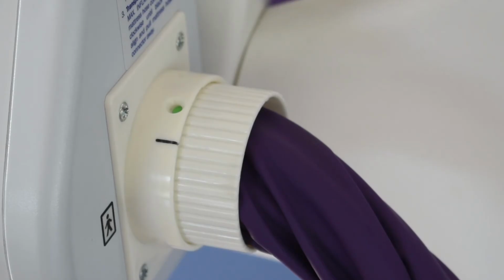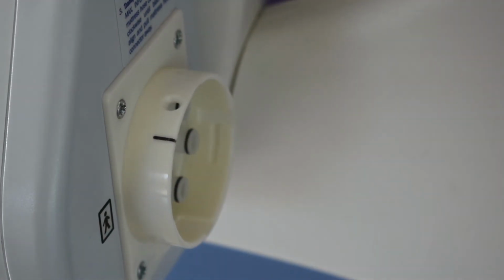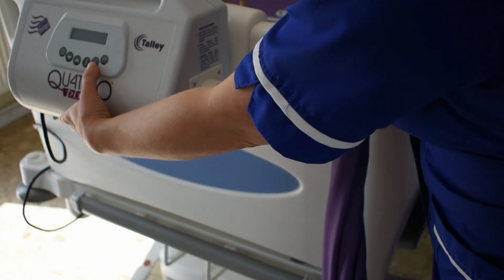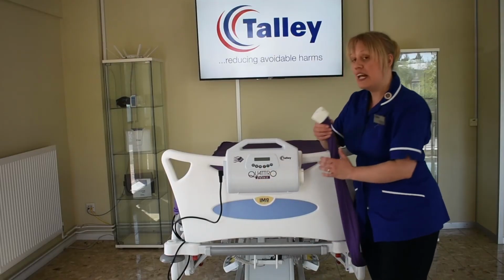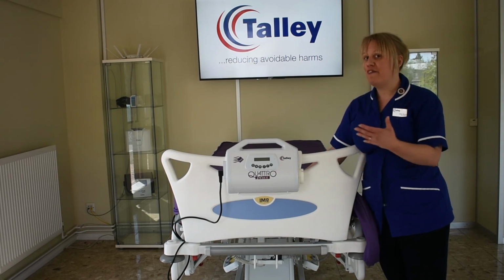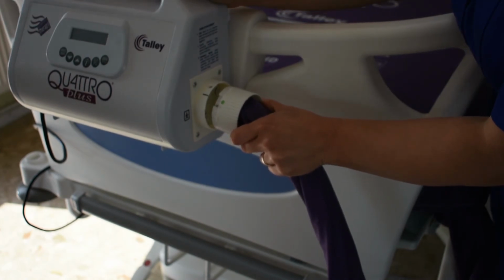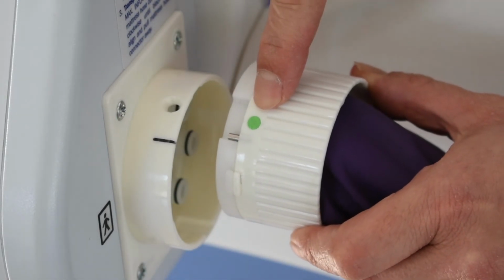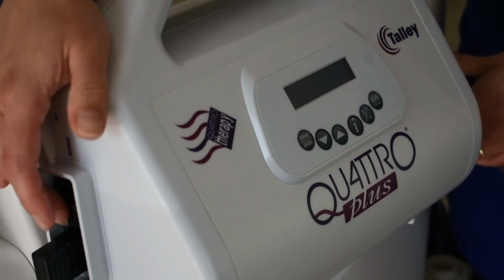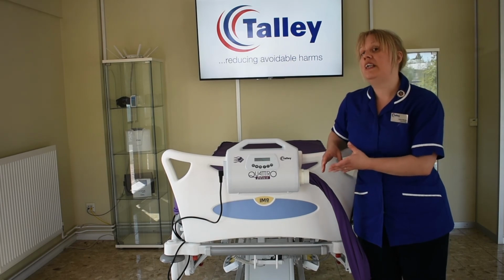So to put your mattress into transport mode, you're just going to take your umbilical and disconnect it from your power unit. You're then going to turn your power unit off. It will beep because it thinks no electricity is getting to it, so just mute the alarm by pressing that dual function button. And then you just put your umbilical at the end of the bed. When your patient returns from wherever it is they've been to, you can then reconnect it, and you just need to reconnect your umbilical by using the green dot on the umbilical, lining it up with the black line on the connector, pushing in and twist to lock in place, and then switch your power unit on. And you can also put your mattress into transport mode in the event of a power cut.